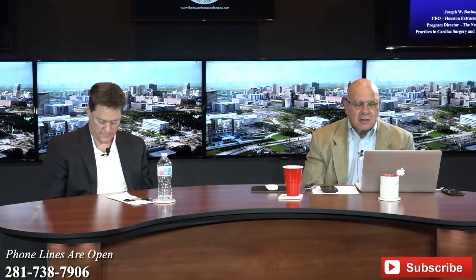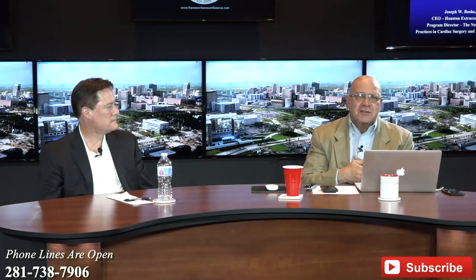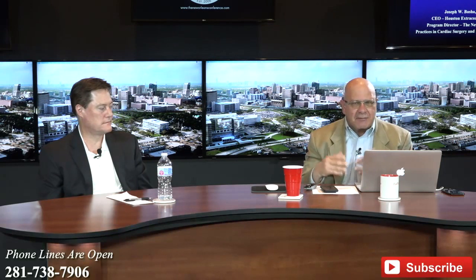Gotcha. So let me ask you this now. For the CardioHelp, my understanding is you are not supposed to cut anything into it to add anything like you did with the CRRT circuit. So was there any discussion about that, or was it just, well, this is what we have to do and this is just what we're going to do?